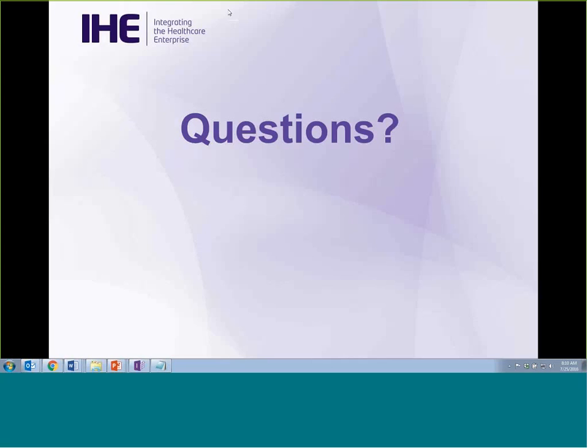Any constraints on the KOS document? It just follows XDS-I.b, also for the remote reporting. I'll let somebody else interpret that question. Sure. If I understand the question correctly, within XDS-I.b, when you share a collection of images, we use what we call a manifest object.